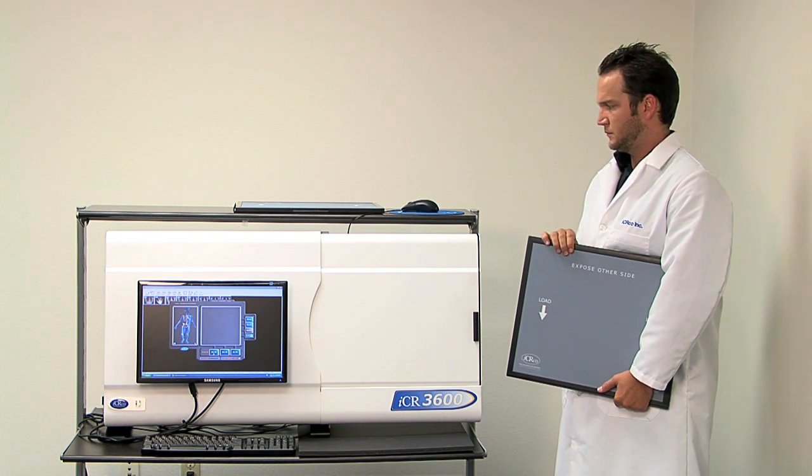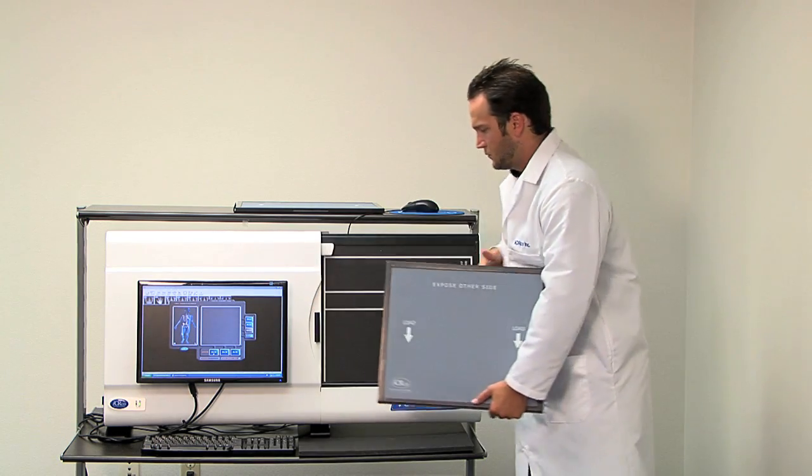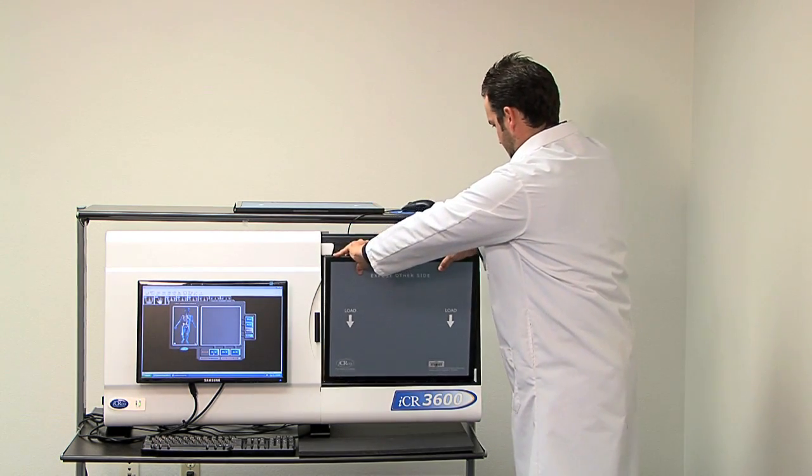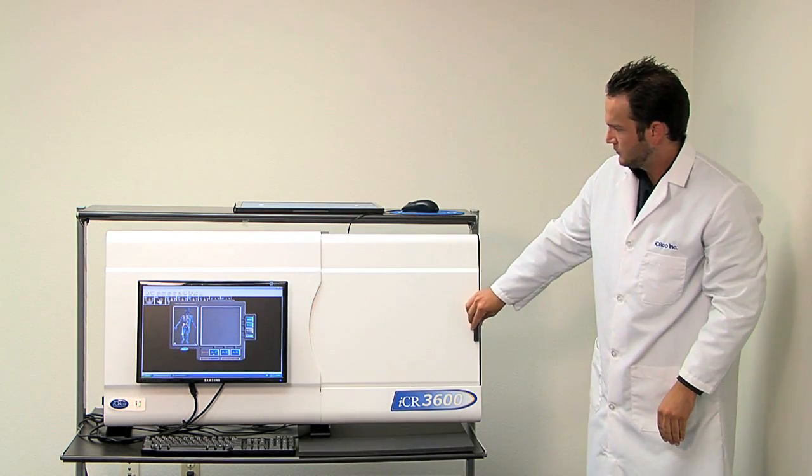Here is how the system works. You open the door of the CR, place the desired size cassette, close the door, and you're ready to scan.